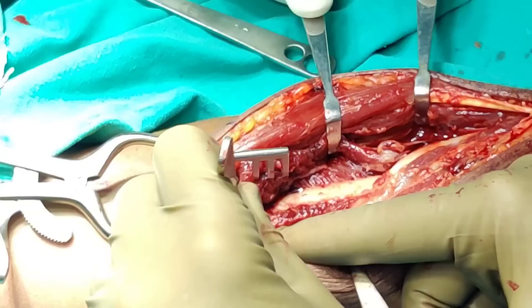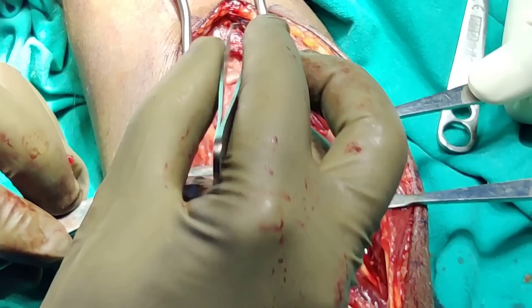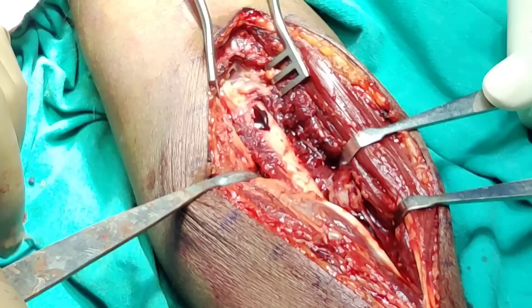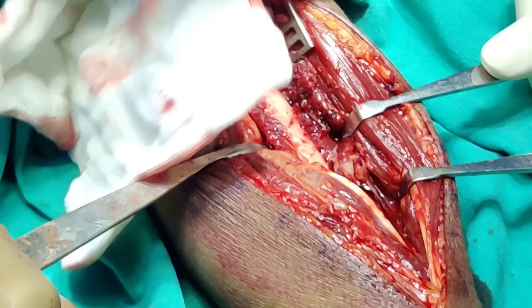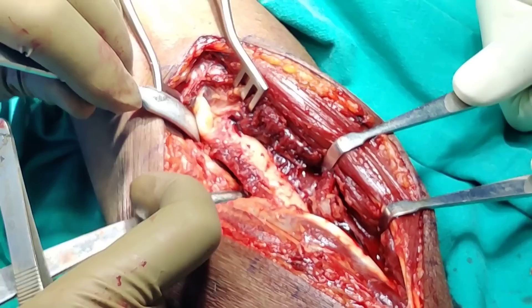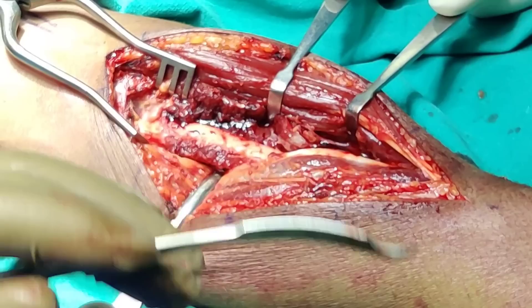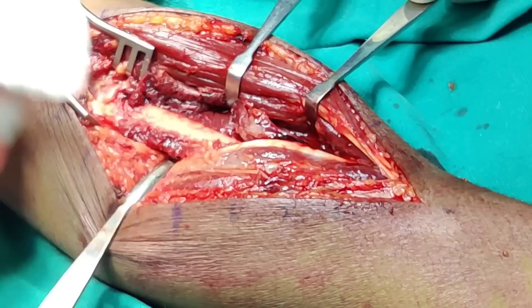You can see we are at the proximal radius — the bicep tendon is visible right here. This is the head of the proximal radius. One important thing: I have put a Hohmann retractor, but my retractor is quite distal. Never try to put a retractor proximally, especially on the lateral side, when working across the proximal aspect, because you have a very good chance of causing injury to the posterior interosseous nerve. I will now carry on, reflecting the pronator teres as I would normally do for a mid-shaft radius and ulnar fracture, and proceed with fixation.